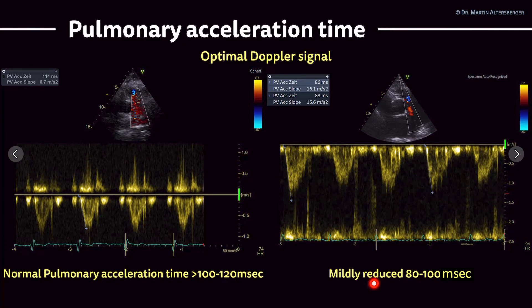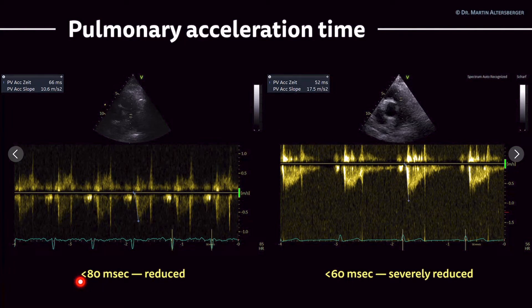On the other hand, you see here a reduced pulmonary acceleration time — here it is between 80 to 100 milliseconds, approximately 87 milliseconds. When you have this kind of measurement, it's definitely reduced. This gives you the information that pulmonary hypertension can be present. If it is more reduced, below 80 milliseconds, it's definitely reduced — we see here 66 milliseconds. And here it is below 60 milliseconds and is severely reduced. The lower and shorter the pulmonary acceleration time is, the more likely it is that pulmonary hypertension is present.